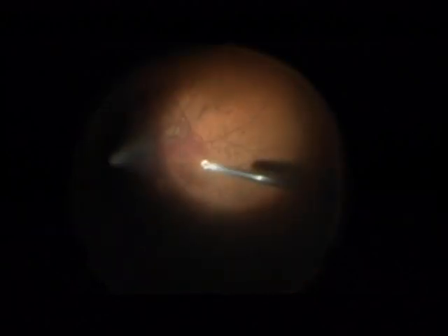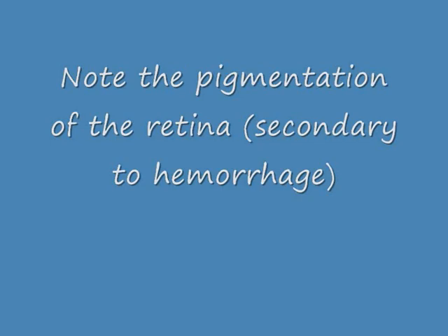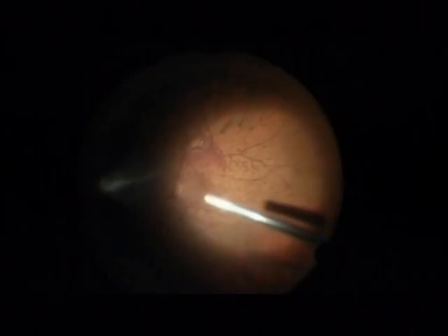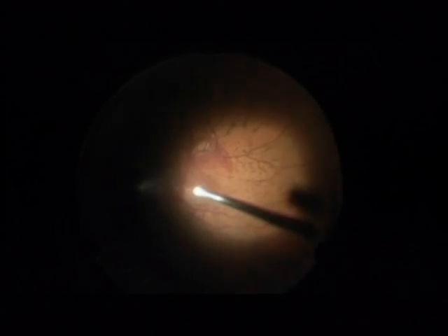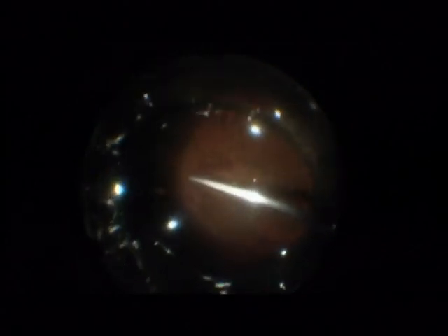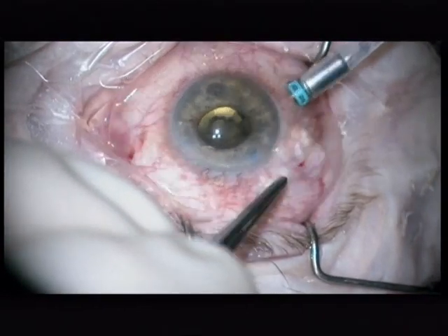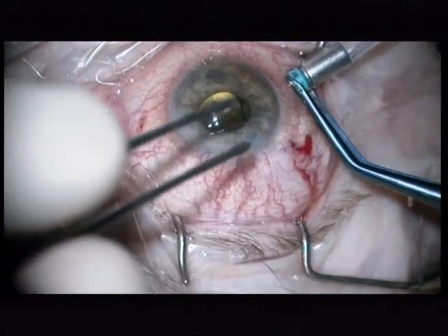I leave the vitreous base of this hemorrhage. Look now — there is a lot of pigmentation on the retina secondary to this hemorrhage, even here. I leave a lot of the vitreous base in order not to have a retinal break. Fluid-air exchange and removal of the trocar cannulas.